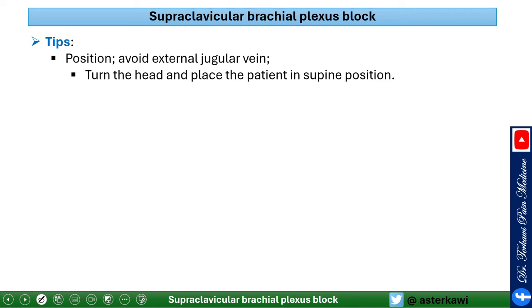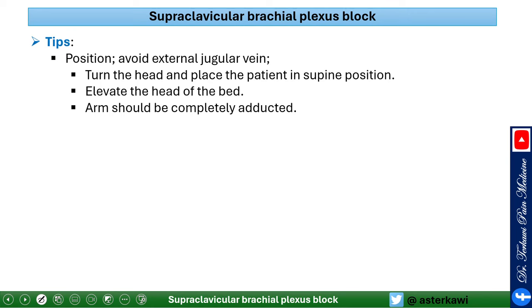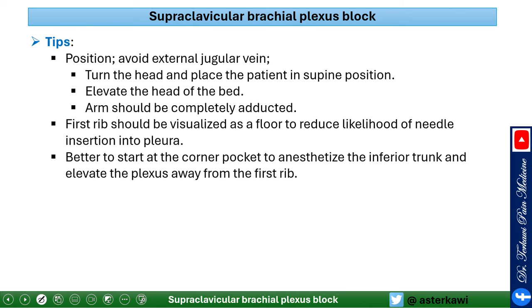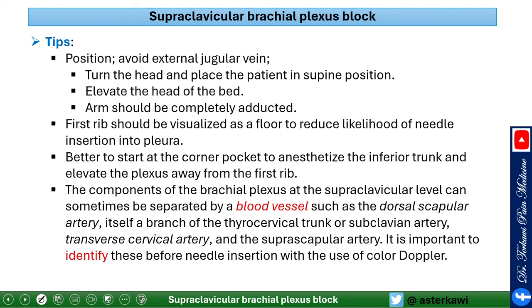Make sure to visualize the first rib — your safety landmark to avoid injuring the lung. It's better to start injecting at the corner pocket to anesthetize the inferior trunk and elevate the plexus, giving more working space. Components of the brachial plexus at the supraclavicular level can sometimes be separated by blood vessels. Use Doppler to identify the dorsal scapular artery, branches of the thyrocervical trunk, or the transverse cervical artery before placing your needle.